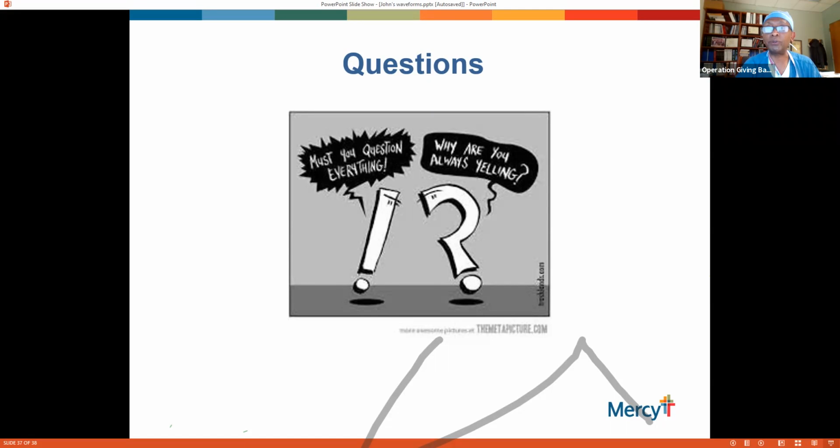So a few questions for you, John. The first question is, can we apply the rapid shallow breathing index for children? Any difference in SBT in COVID-19 patients? Okay, so we don't use it on children at this point. And yes, we do use it on our COVID-19 patients. We are just like with other patients, trying to get them off as quick as we can. So we need to test them, look at them and see if they qualify, and then try this on them.